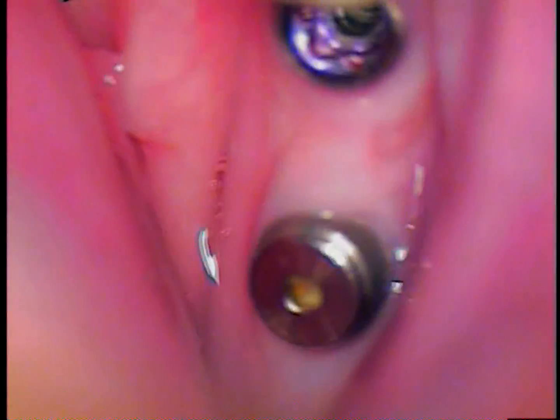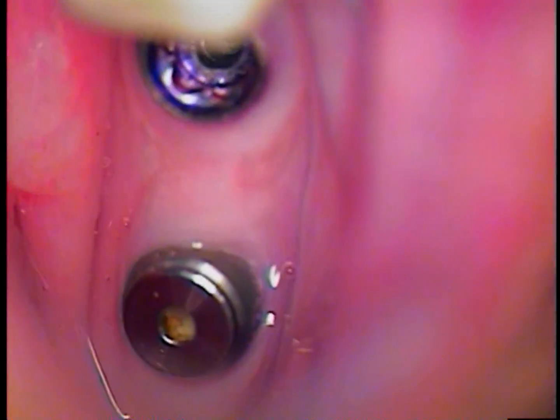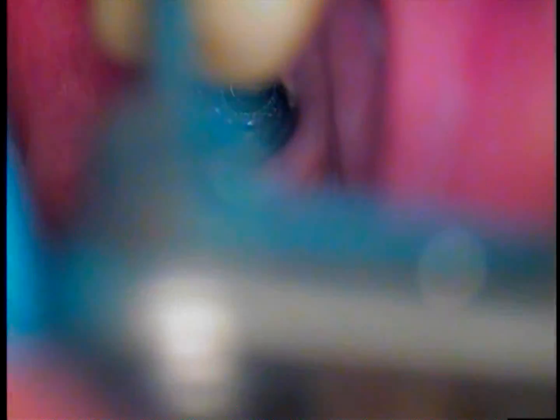Okay, another attempt made. See I'm kind of vibrating it in place and I'll make the turn. And it's very difficult, very difficult to move this, to get it to budge. And not only do you have to have patience, but the patient in the chair has to agree to, you know, it does take time. You might be here for an hour, maybe two hours. Here we are extending it already to probably around our third hour.